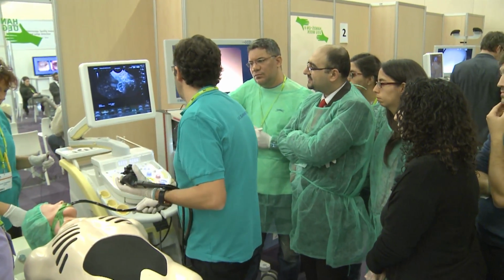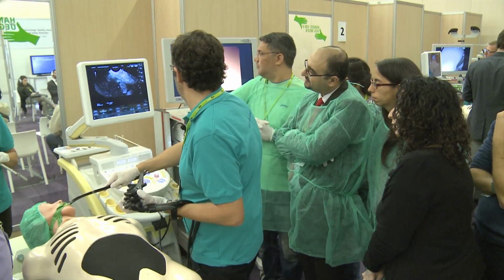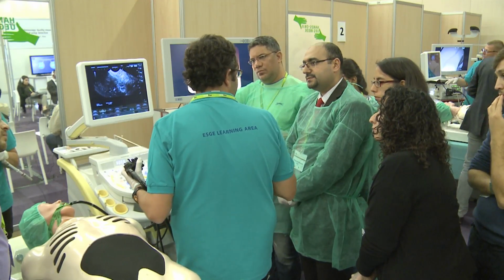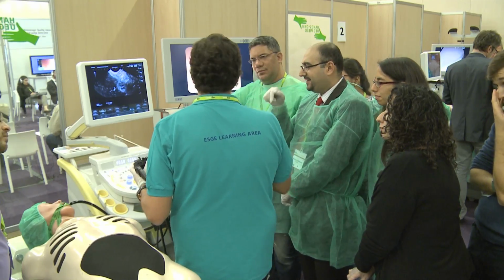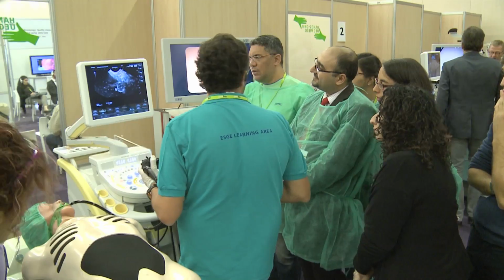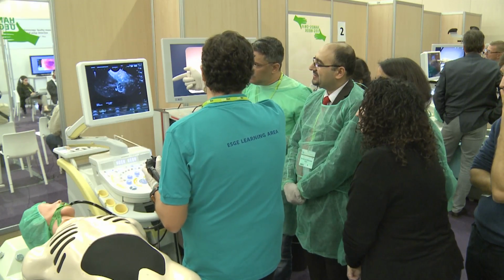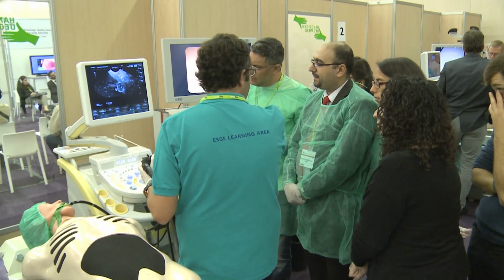So, your turn. To make it easier, the best technique, the best lesion to start with, are cystic lesions, because they're very big, softer, and it's very easy to see the tip of the needle. So since we have a very nice cystic area with well-demarcated margins, it's very nice because you are going to see the difference, and it's better for you to get the image of how to put the needle inside.